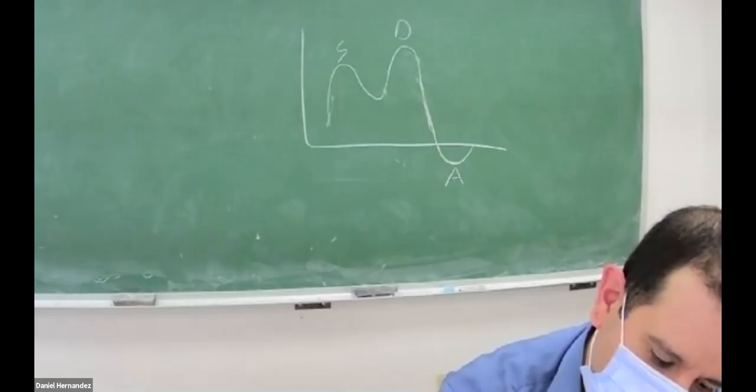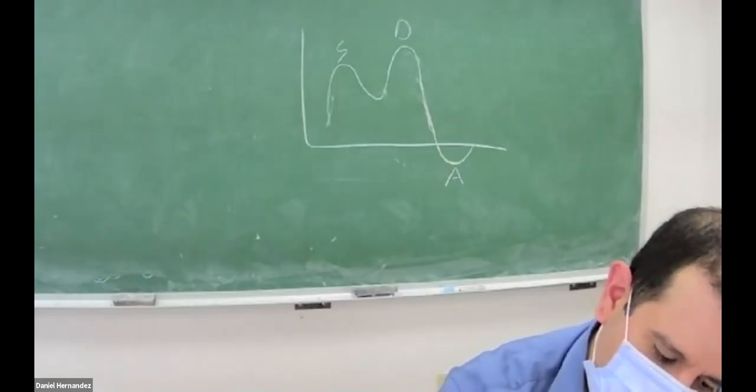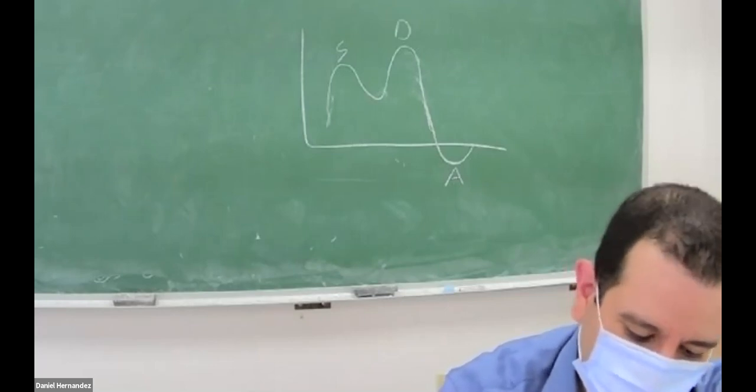I'm changing mine to left atrium. Somewhere on the left side. Right sinus of Valsalva aneurysm usually protrudes. Wait, right side? I don't know. I'm confusing myself. Elena, you said right ventricle. Yeah, right ventricle.